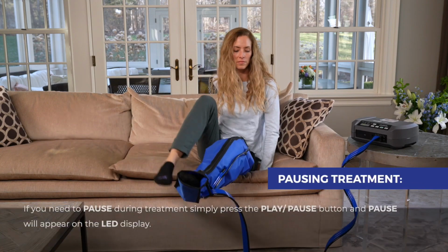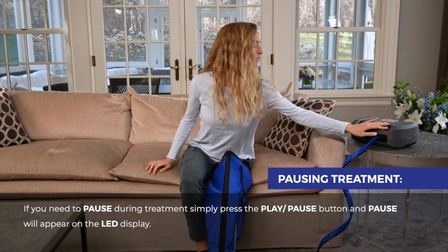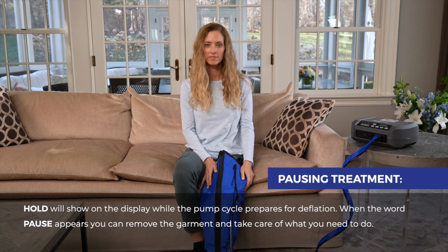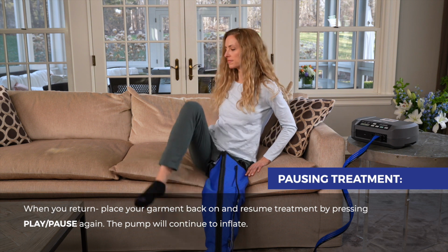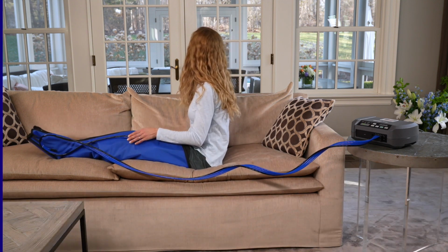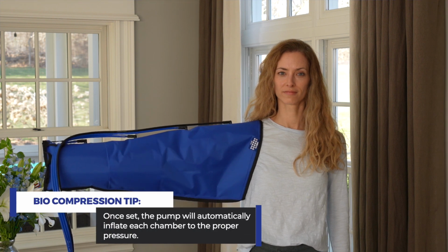Pausing treatment. If you need to pause during treatment, simply press the Play Pause button and pause will appear on the LED display. Hold will show on the display while the pump cycle prepares for deflation. When the word Pause appears, you can remove the garment and take care of what you need to do. When you return, place your garment back on and resume treatment by pressing Play Pause again. The pump will continue to inflate. Once set, the pump will automatically inflate each chamber to the proper pressure.